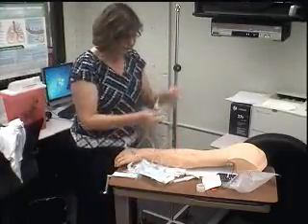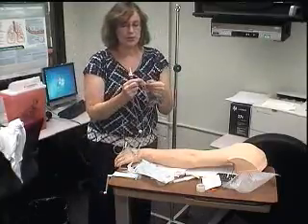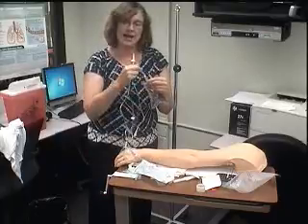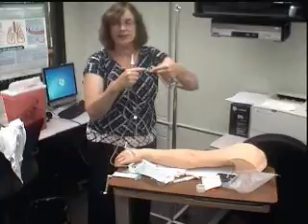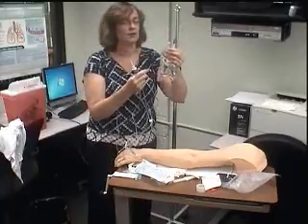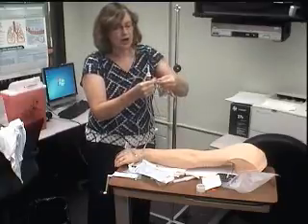So then I've got my fluids, and I'm going to look and see which side needs to be pulled off. Sometimes it looks different, it's hard to tell, but it's the one that does not look like you can stick a needle in it, because the pharmacy uses this to clean the port and stick a needle in it with solution, so they may add antibiotics to saline or whatever. So you take off the other one.